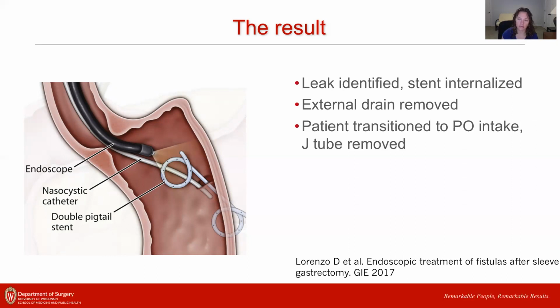I then transitioned her over to oral intake. She was not using her J tube after several weeks, and so we took the J tube out, and then ultimately the internal drain was removed.